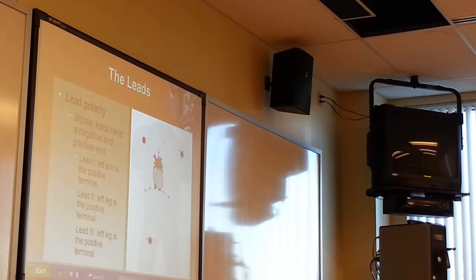Okay, lead polarity. Bipolar leads have a negative and positive end. Lead 1 is the left arm, it is positive. Lead 2, left leg is positive. Lead 3 is positive.